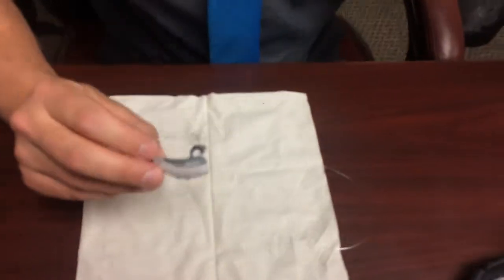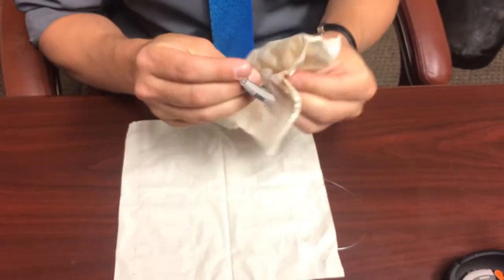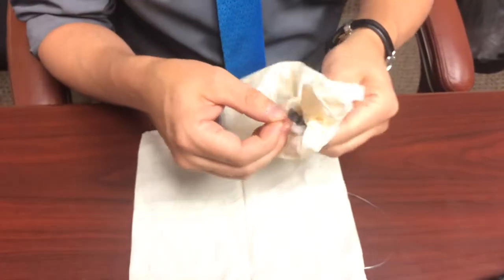Hi, my name is Levi and I'm going to show you how to clean one of these Serium hearing aids. First, I'm going to take and wipe down the dome and the hearing aid with a piece of Kleenex.